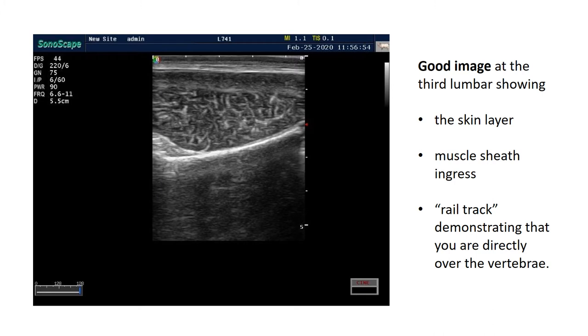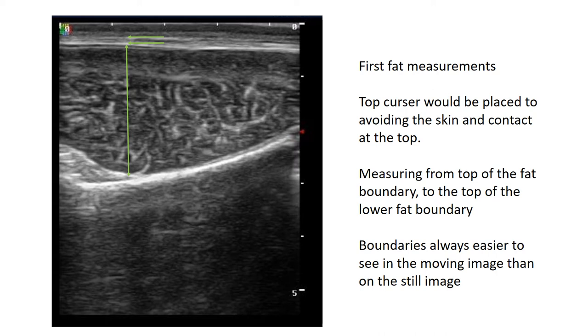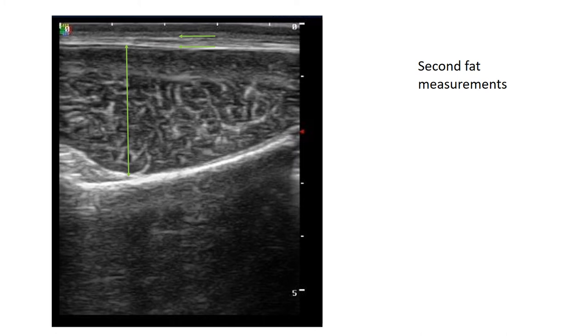Here's a good image of the third lumbar vertebrae. You can see the skin layer, the muscle sheets being picked up, and what technicians refer to as the 'rail track' - showing you're directly over the vertebrae, with repeated lines of reflection indicating a clear image at the right point. When placing cursors, be very careful to avoid including the skin layer, and measure from the top boundary of the fat to the top of the lower fat boundary - not from the top of one boundary to the bottom of another. The boundaries are always easier to see on a moving image than a still one. These would be the first, second, and third fat depth measurements.